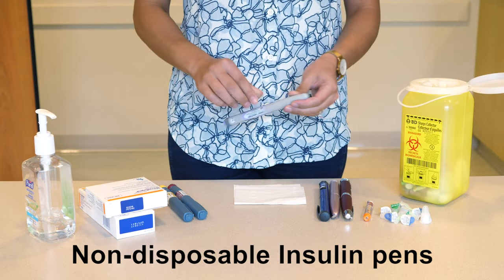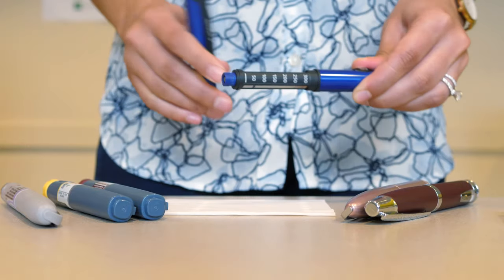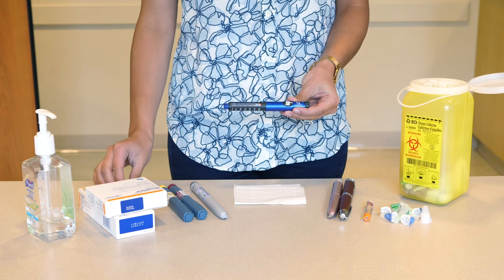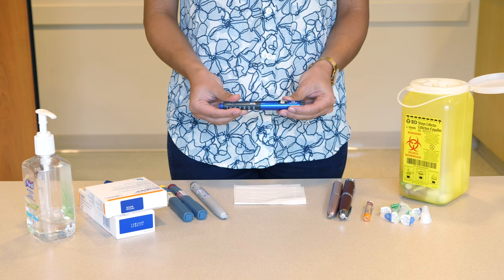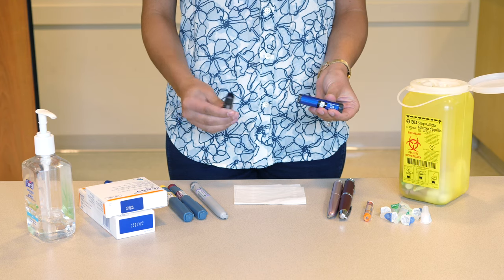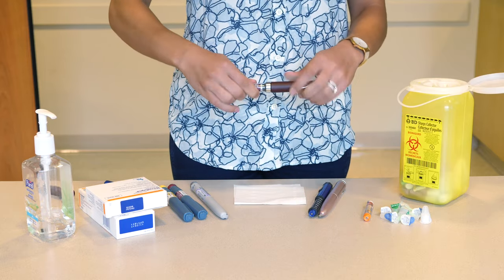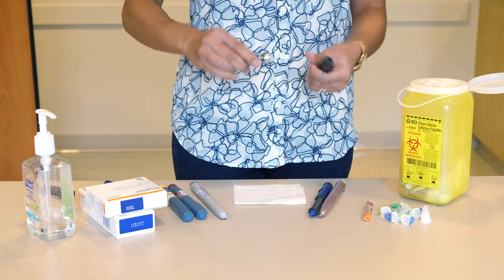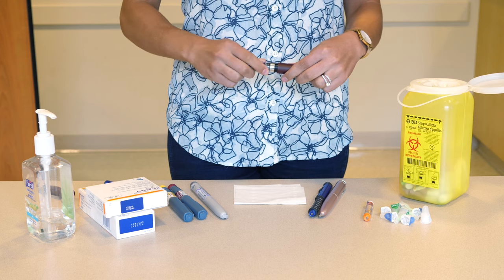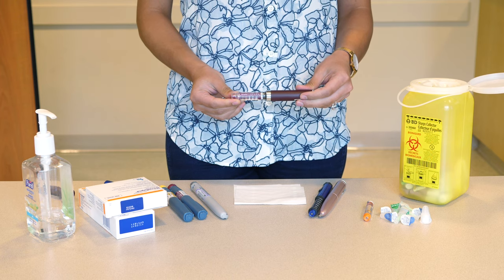Some insulin pens are non-disposable. They have a reusable pen which holds an insulin cartridge that is inserted into the pen. To open and replace the insulin cartridge, some of the non-disposable pens twist, with the two parts of the pen moving in opposite directions. Other pens unscrew. The insulin cartridge is put into the pen with the smaller end going in first. Non-disposable pens also have a plunger. Once the plunger is at the end of the insulin cartridge, you must replace the cartridge in the pen.